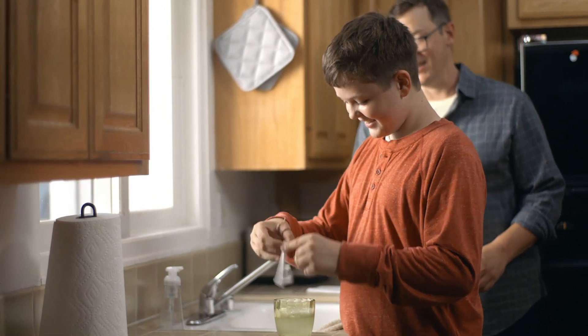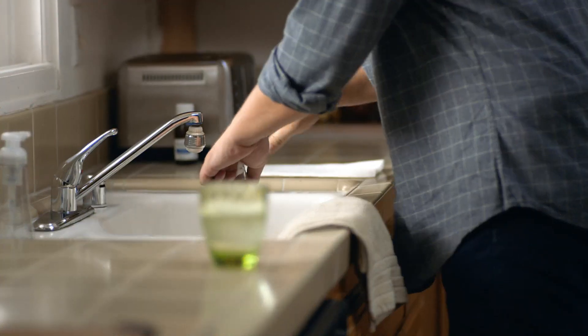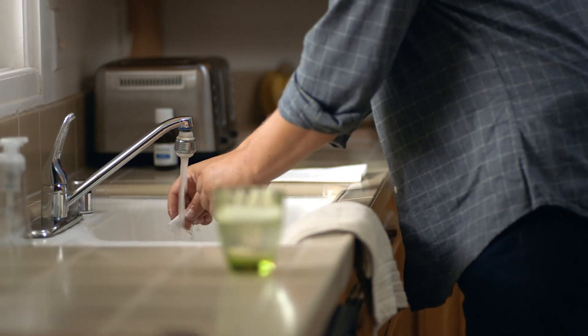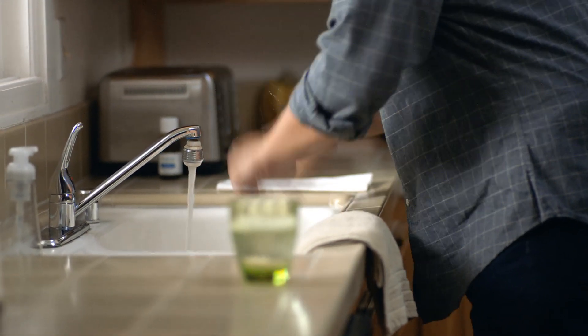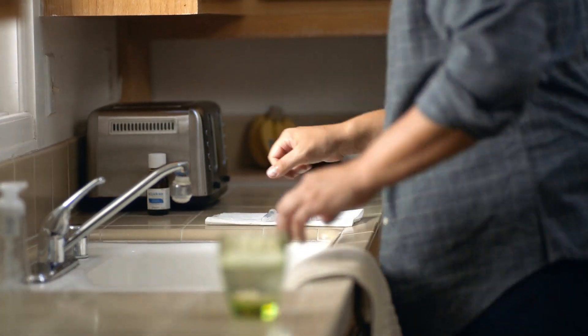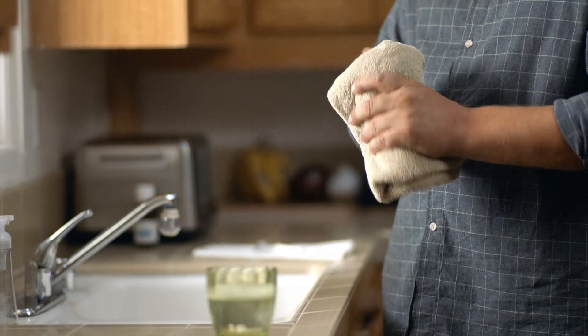Once it's clean, just rinse both pieces under tap water, shake them off, and let them air dry. Be sure the syringe and plunger are completely dry before using them again — if you don't, the medicine can get cloudy. But don't worry if that does happen; it doesn't change the safety or how well the medicine works.